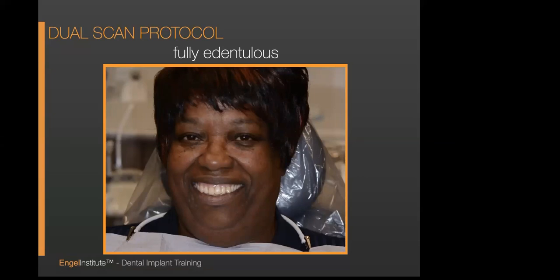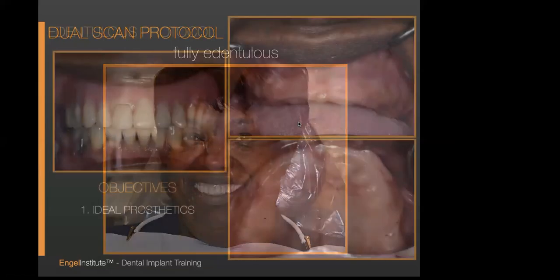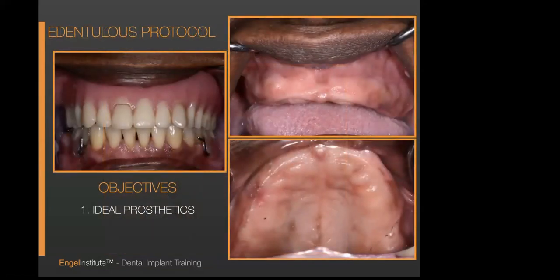And I say okay to scan her. If the VDO is collapsed, if the teeth are all ground down, if half the teeth are cracked, then we are not going to use it. But if the patient comes in after X amount of years, which you're going to see right here, and says, listen, it's ugly, I don't like anything about it, but I'm actually comfortable, I can eat, I can do everything, this is the denture that you want to scan the patient with. You do not want to put a brand new leather shoe on the foot and have them try to bite this thing down so you can get your information.